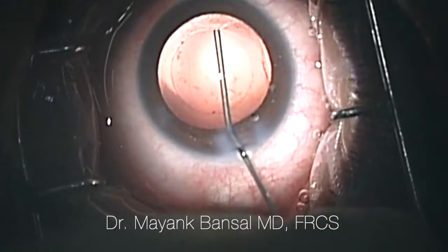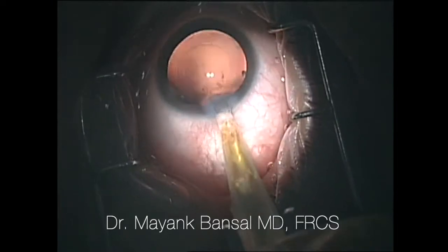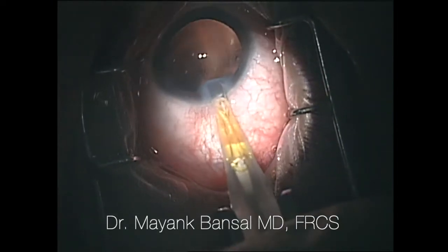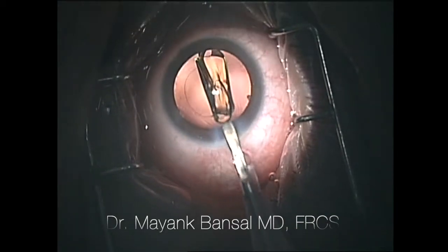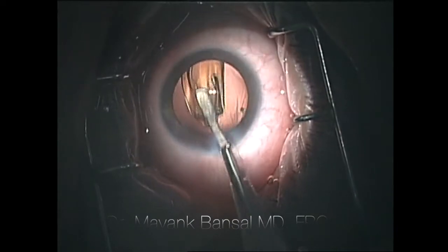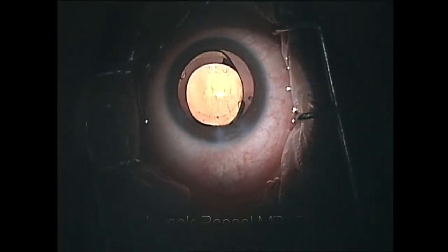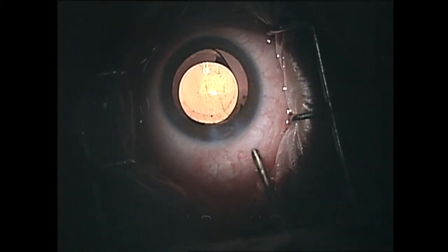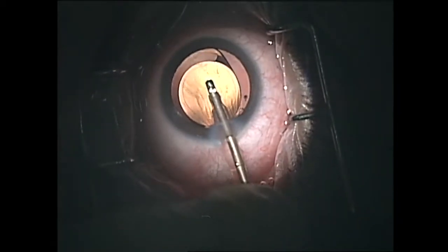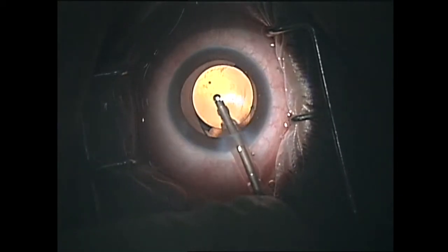For that, we first fill up the bag with the viscoelastic gel, which allows us to get a nice centered position for the IOL. This is the foldable lens being injected, and it beautifully opens up inside the capsular bag. We're nudging it into position and it opens gently. With the lens well centered, we now aspirate out all of this viscoelastic gel, and that's towards the conclusion of the cataract surgery.